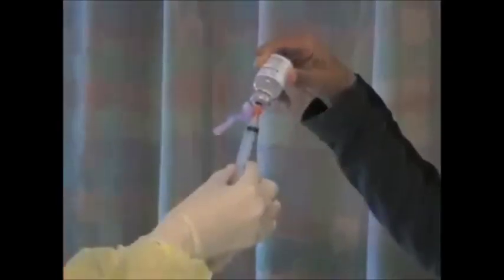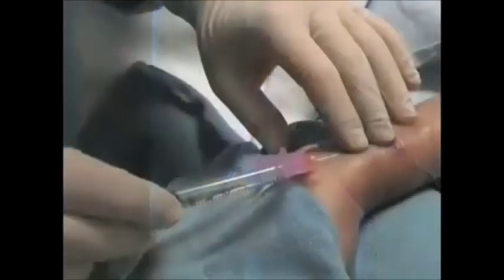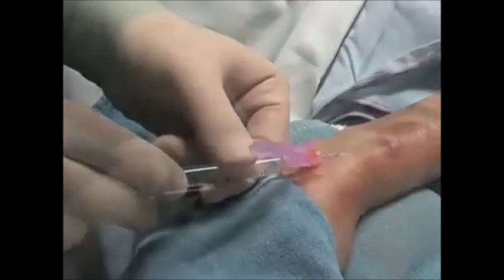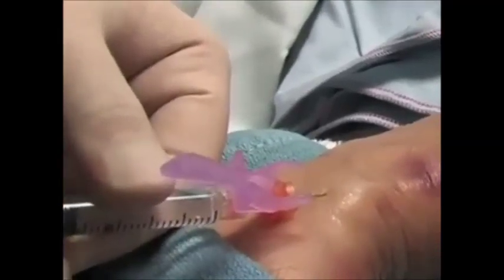Using the 5 cc syringe and small needle, draw up 1% lidocaine. Upon introducing the needle under the skin, draw back on the plunger to ensure that you have not punctured a vessel. Inject a small wheal of analgesic around the artery and wait 30 to 60 seconds for the lidocaine to take effect.